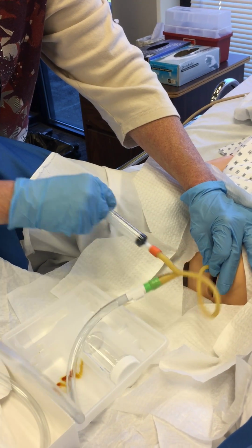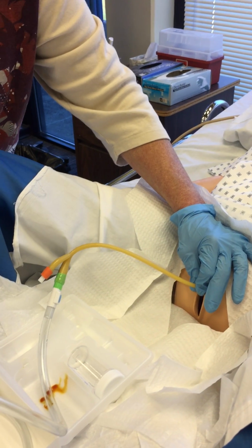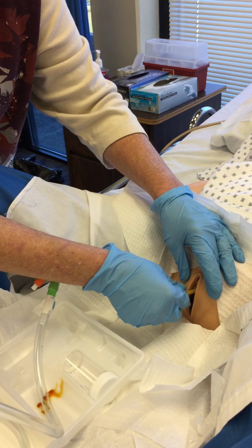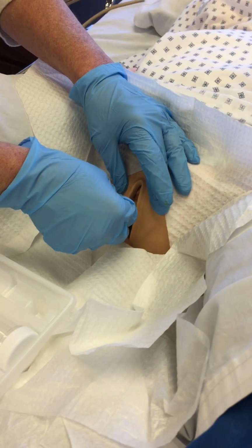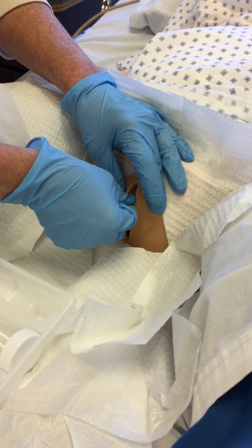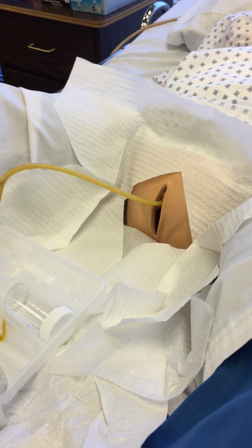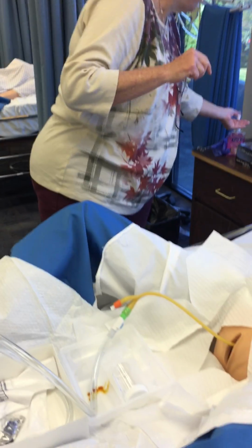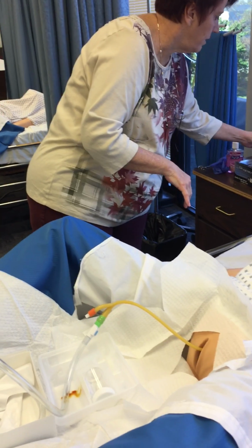Now, if you don't take this off, that saline's going to come right back out. So now, tug on it to make sure it's in the bladder, because you'll have that couple inches left, and then push it back up in there a little bit so it's not resting right on the neck of the bladder. Okay? Now you can take your sterile gloves off. Wash your hands again. Put on some clean gloves.